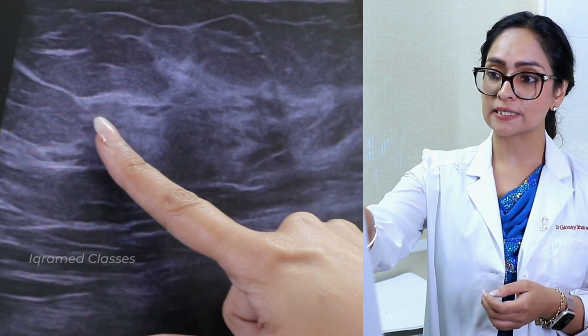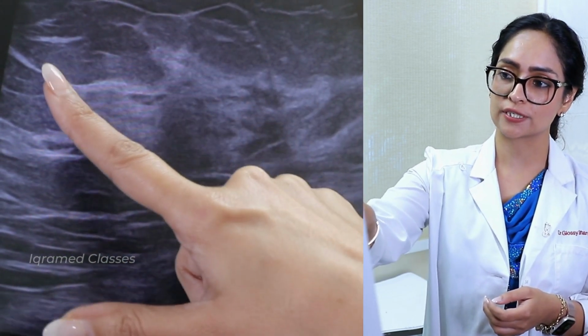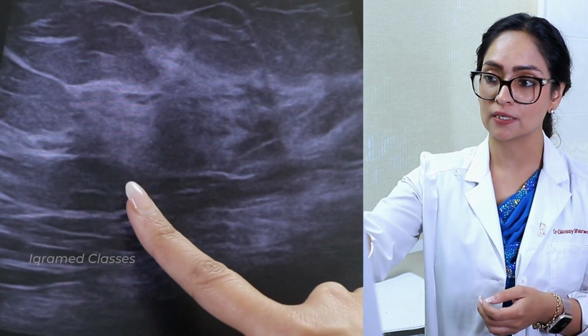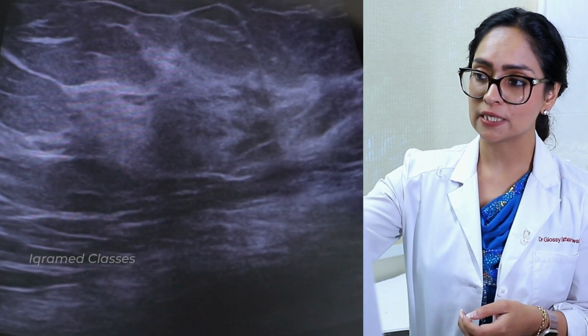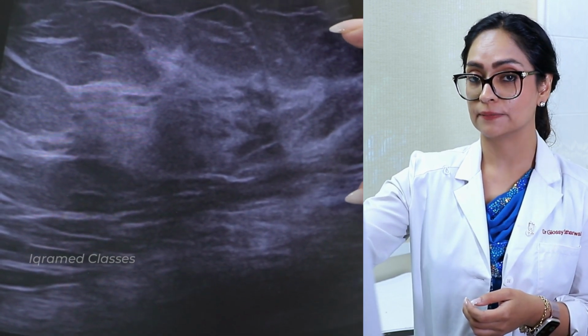And Cooper's ligaments and fibrous tissues are seen as these strands that you see, the echogenic strands giving shadowing in between. So if you know how the mammary tissue looks like, then you will be able to pick up abnormality.